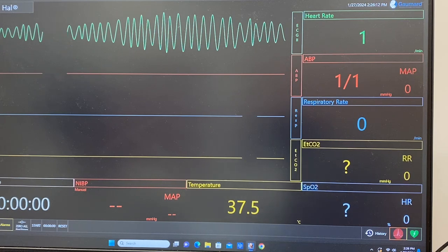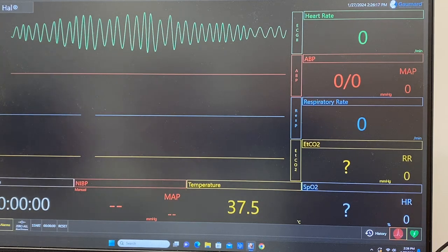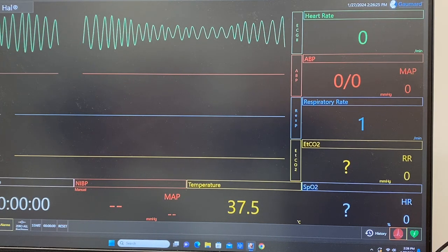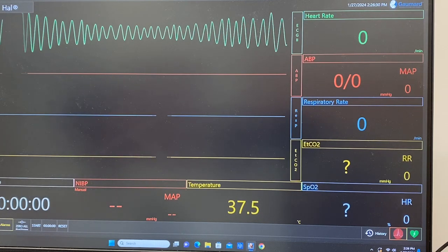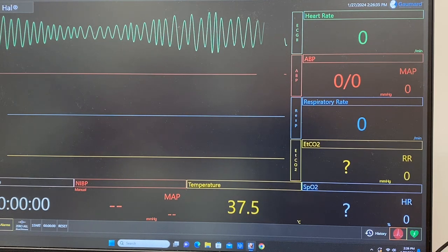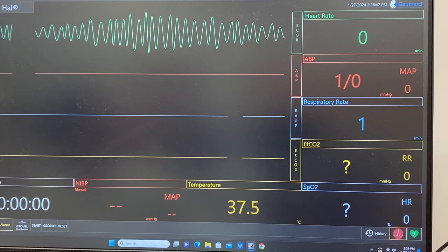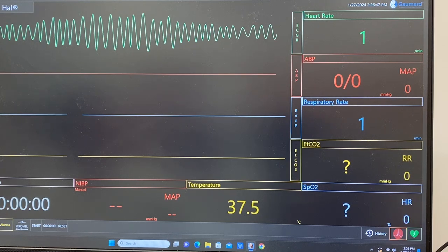We learned that with electrolytes. That happens with hypo something. Hypo what? Calcemia? It could, but usually our first thought is hypomag. Hypomagnesemia. So that's one potential cause. Or associate the party streamer because people who party use drugs. Drug toxicity is another potential cause of Torsades.